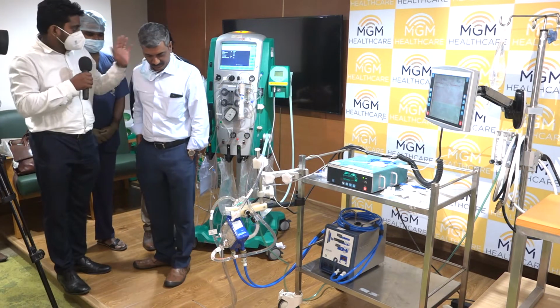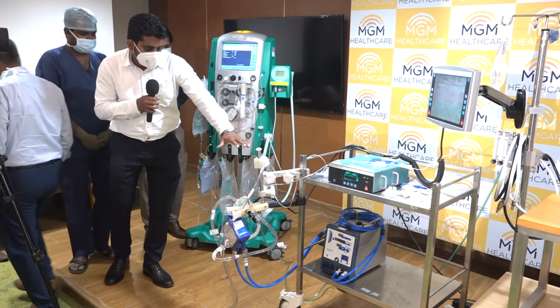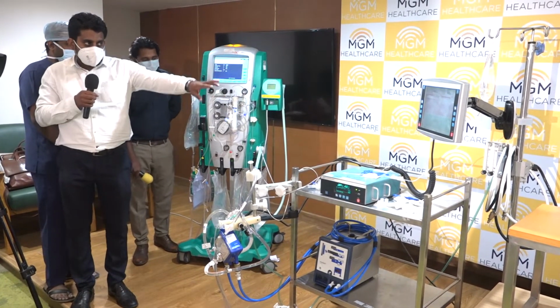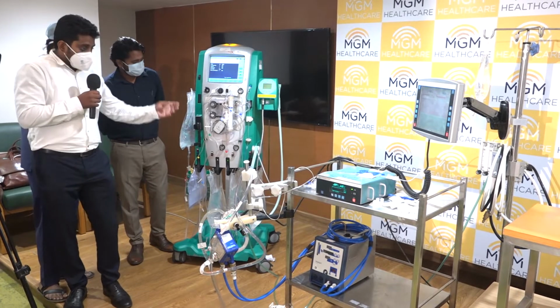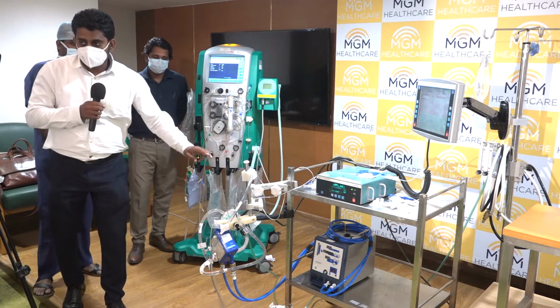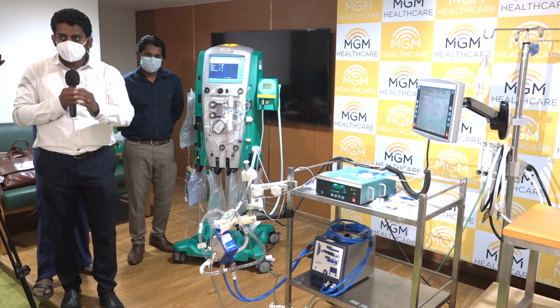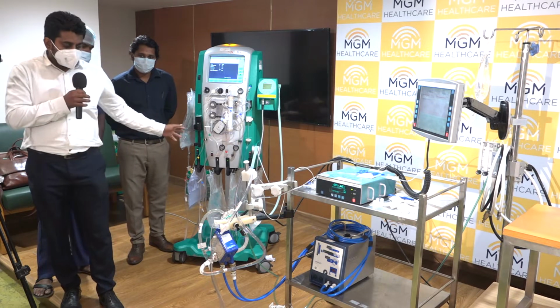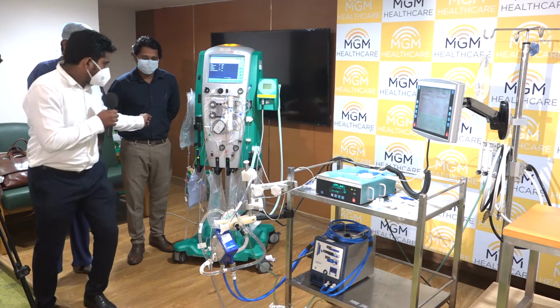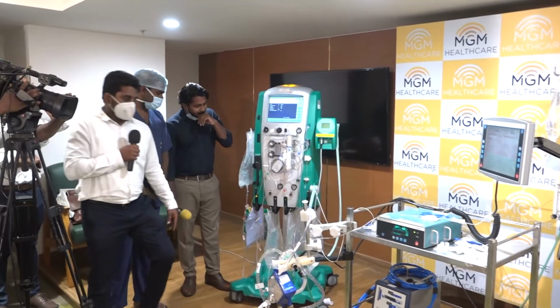Now let's see how the CRRT circuit is getting connected with the ECMO circuit. Let's assume that the ECMO is currently running with a rotation speed of 2900 RPM. There are multiple options to connect the CRRT circuit between the oxygenator and the pump, but there is only one option which will not give us frequent alarms. I'll demonstrate that option first, and then subsequently go to the other options. Ramesh, over to you. So the CRRT is ready now, and he's going to connect this.